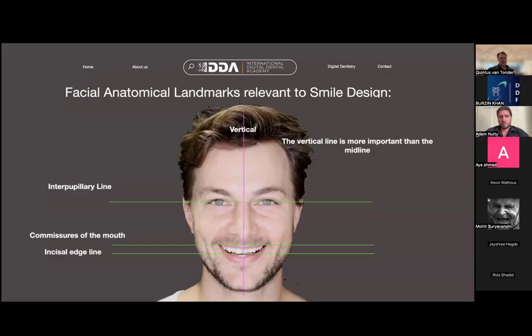Now, the way that you normally see you've made a mess up is when you get to the end result and either the midline is out or the midline is canted or the midline and the whole design looks good, but then when the patient holds their head in a normal position, it can look canted. Now, I've made the mistake many times of designing a smile to what I think is the actual correct vertical and horizontal dimensions, but then it ends up as a completely canted smile when the patient is walking around or just holding the head in the right position.